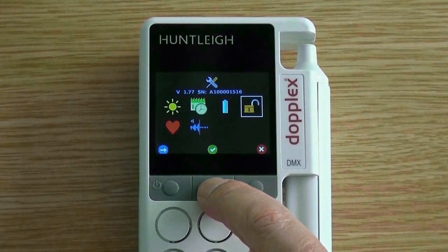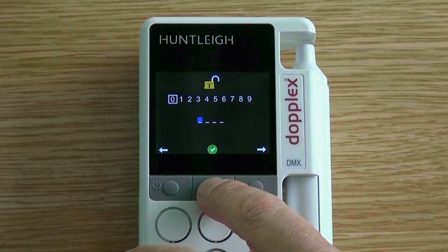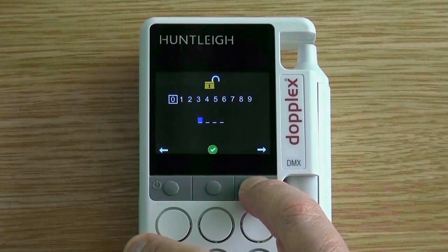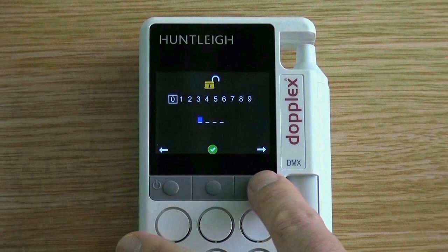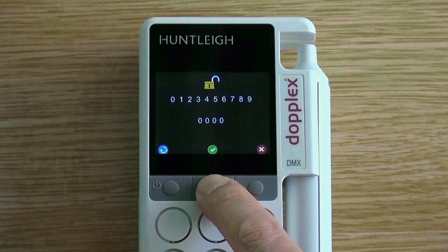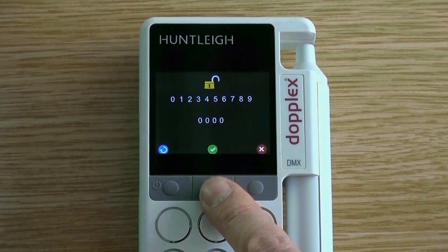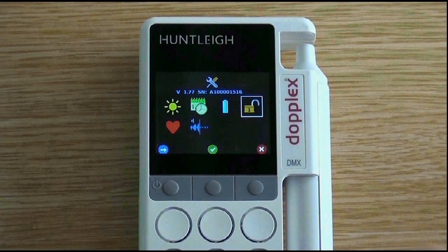With the pin lock icon highlighted, press the middle button. Use the left and right buttons to select the desired numbers — in this case we will select four zeros. If the pin is to be accepted, press the green tick. If you do not want to create a pin code, press the red cross. Creating a code locks the saved database on the unit. To unlock the database, enter the correct pin code and press the green tick.